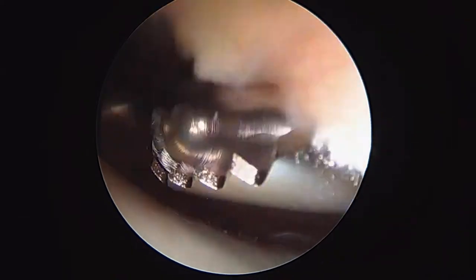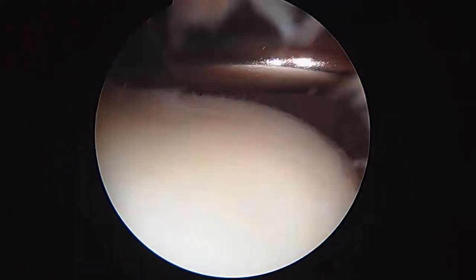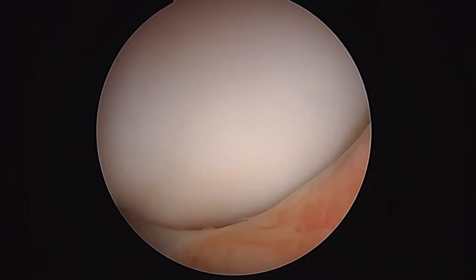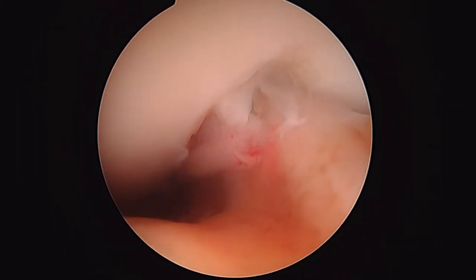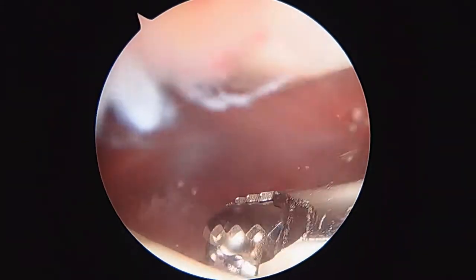There's a little bit of an abundant fat pad. We're just going to do enough resection so that we can see right now. We can track this all the way down to the front of the knee — you can see the anterior cruciate ligament as it tucks underneath in the notch. We'll come back up to the patellofemoral joint.